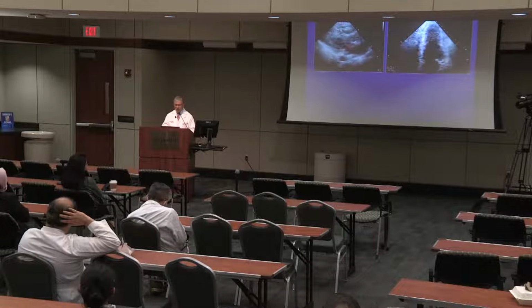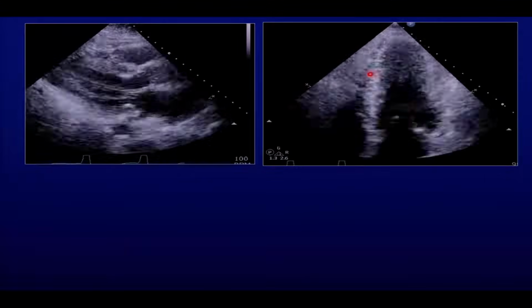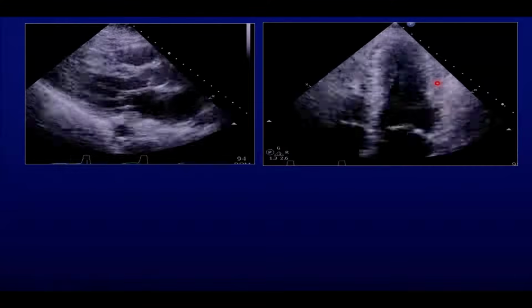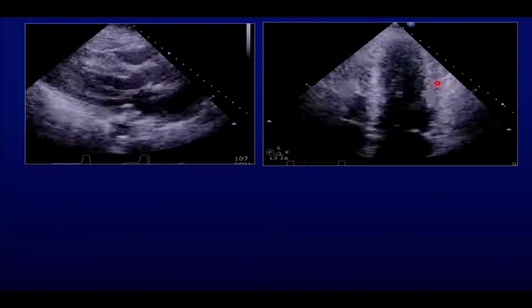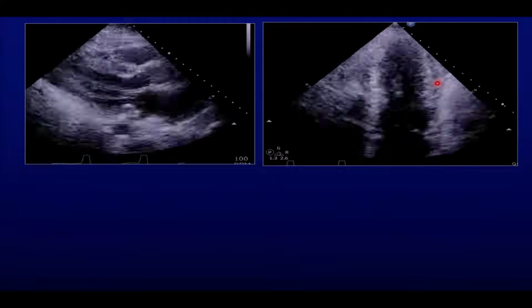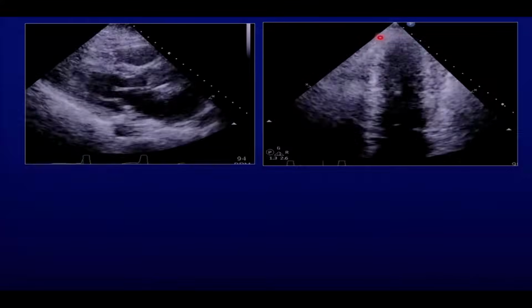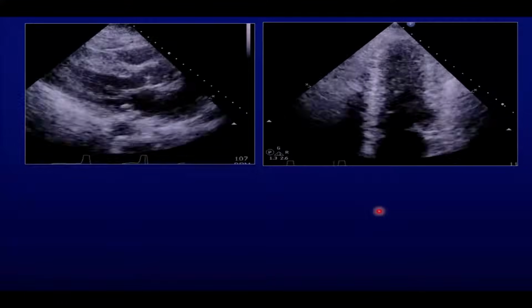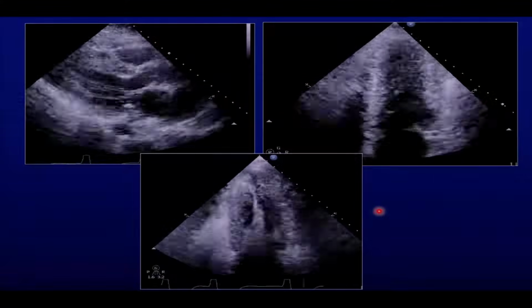Hard to tell on the parasternal long, but here, as I say always, there's also the outside border of the heart that is not coming into the ventricle. The differential is two things. Either akinesis in the apex that you're not seeing, or too much muscle that you have no motion, right? So you could see the difference here. On the outside, the epicardium doesn't move as much. So whenever you have what looks like an apical abnormality and you cannot see, this is your apical hypertrophic cardiomyopathy.